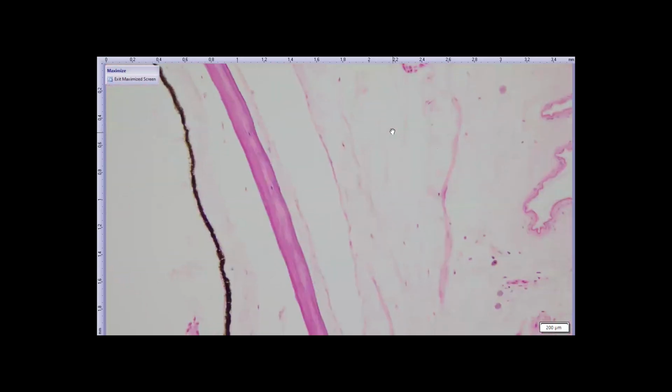The epithelial nature of it doesn't quite approach what we see in the snake. I'm not sure why that is. And then over the top, we have the brill or the spectacle. And again, there's this completely acellular keratinous layer. I'm not sure if that's called an outer generation in a gecko, but this is what sloughs during ecdysis. Geckos can have similar dysecdysis problems as snakes, and that acellular keratinous layer also sloughs from the surface of the integument.